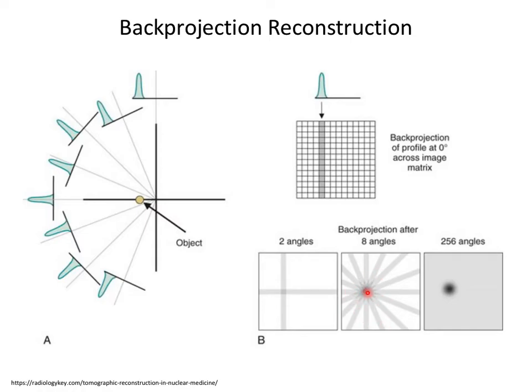And then if I do 256 projections, I can recover the signal of the entire background and the dot. Here you would have a pretty funny looking image because you have all these stripes out here. This is a pretty funny looking 2D image because it looks like a, I don't know, a flag or something. But you certainly know where the dot is if all you care about is where that dot is. So there's an interesting balance between spatial resolution and image artifact here.